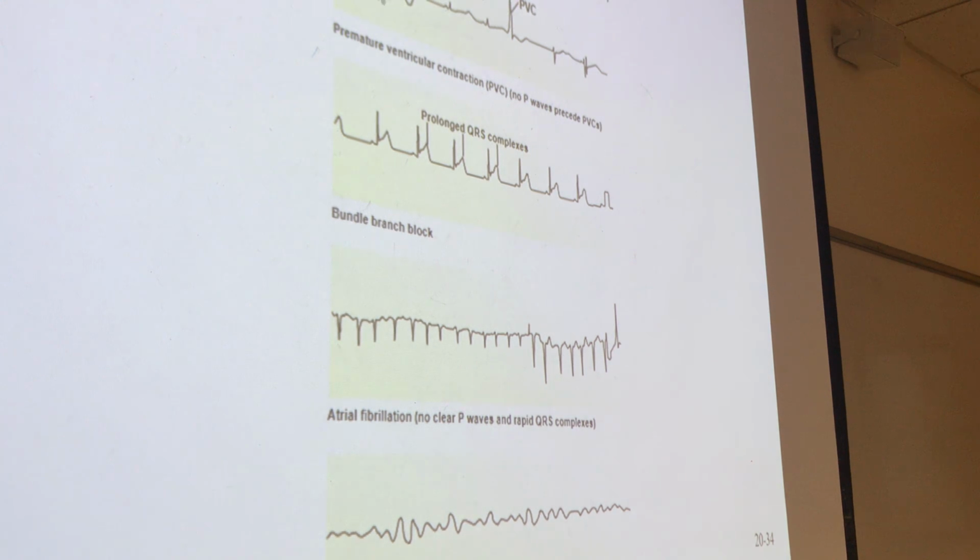And you can see it right here, right? This person, if she's having this many PVCs, she probably needs to get some ablation done. I'm saying she because it's more common in women. You say a panic attack or what else? It can cause panic attacks, right? Usually it causes a prelude to it because you're having all these premature ventricular contractions, and now your heart skips. That's what it feels like. Now, a prolonged QRS right here can also be caused by a delay in the messaging of the ventricular muscles.